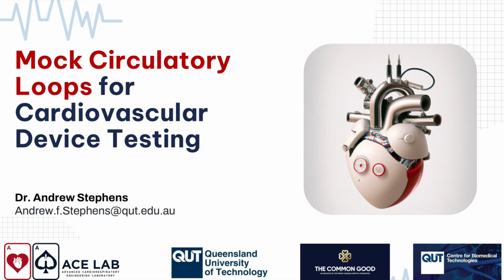The calculation that we use for resistance is pressure at one end of the system minus pressure at the other end of the system, over cardiac output. So that's the pressure drop we're interested in over cardiac output, or flow.